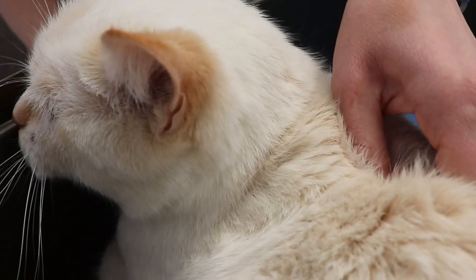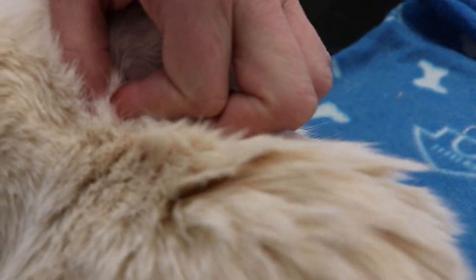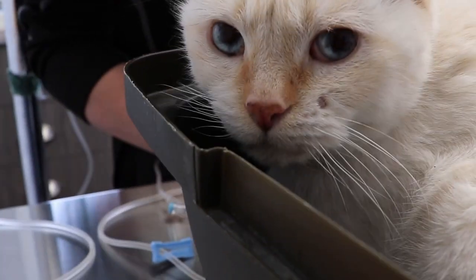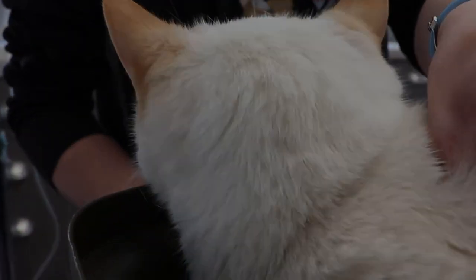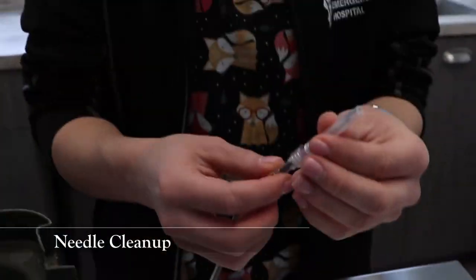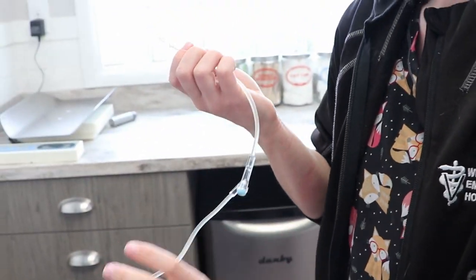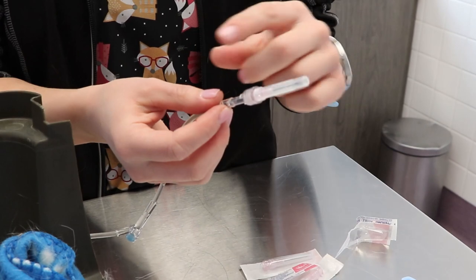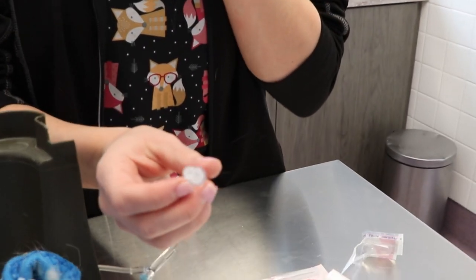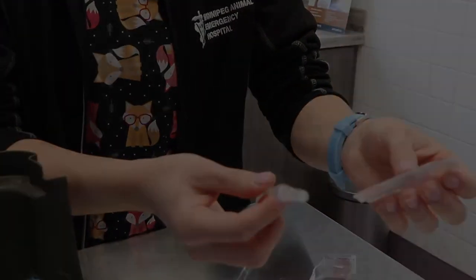Okay, there — it's all done. Yeah, I know, that's the look of an impressed cat. You can do it one-handed like that, just be careful that you don't poke yourself. And it is recommended to change the needle right away after so that bacteria doesn't travel up the line. I can let you do it if you want to give it a try. Sure, just a second.